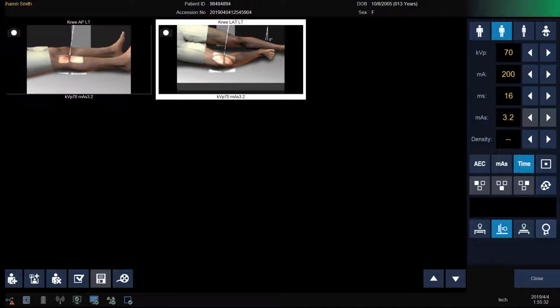Select your workstation. Verify your generator settings based on patient size. Position your patient and make your exposure.